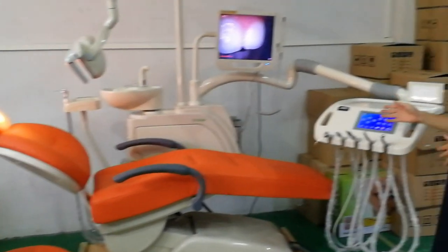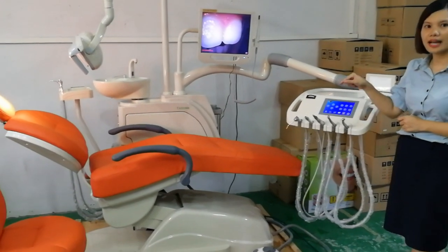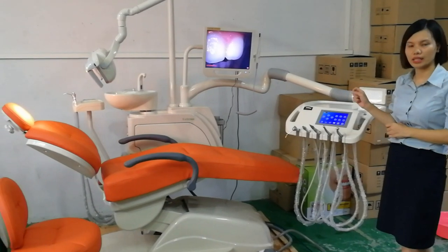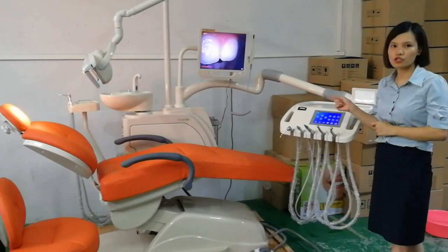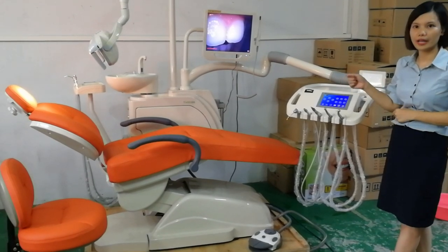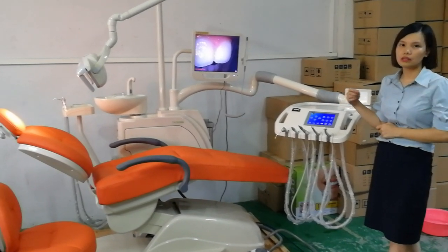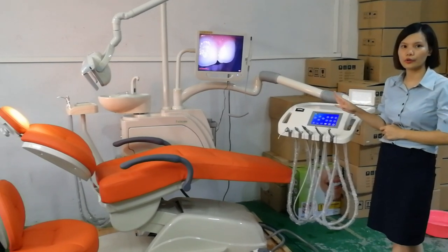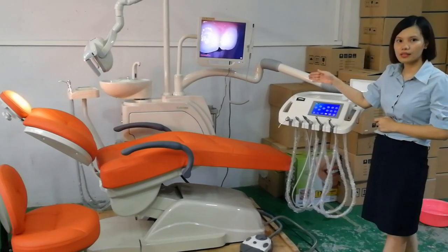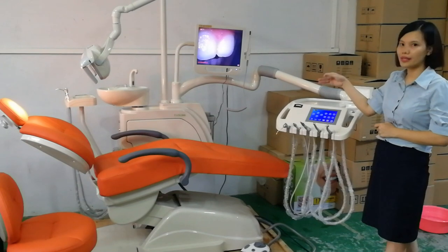For this system, we improved four points. First, for the traditional memory chair, the memory is inside the motor. The shortcoming is that memory is normally affected by electricity. If the chair loses its memory, the solution is to change the motor — but changing the motor is very difficult for the engineer, and they will charge a lot, around $400. Our improvement is that we built the memory into the PCB instead of the motor. So if something happens to the memory, they just replace the PCB — that's all.